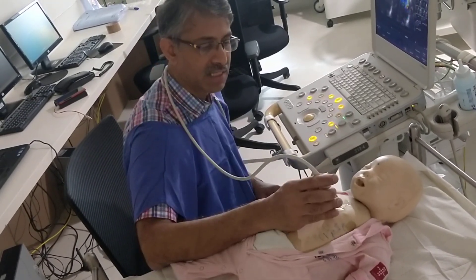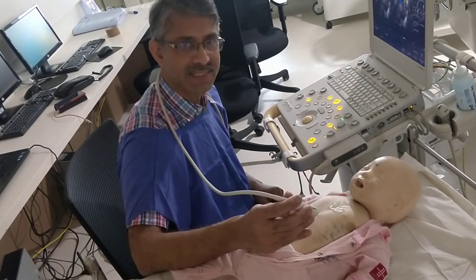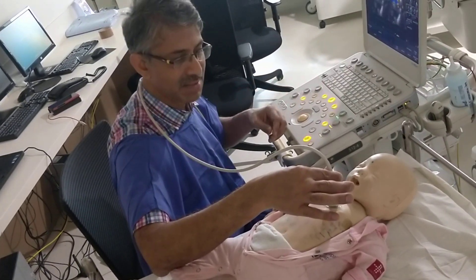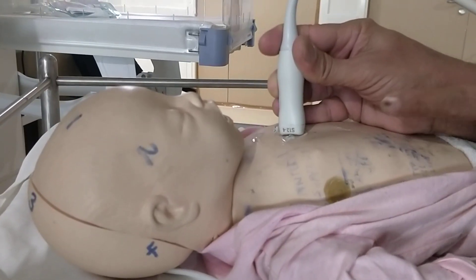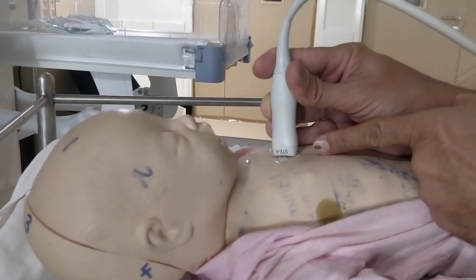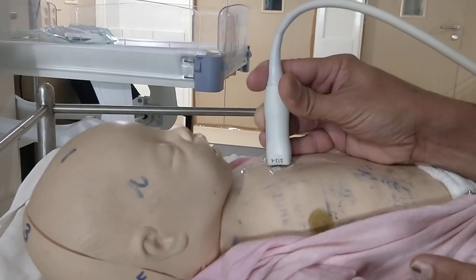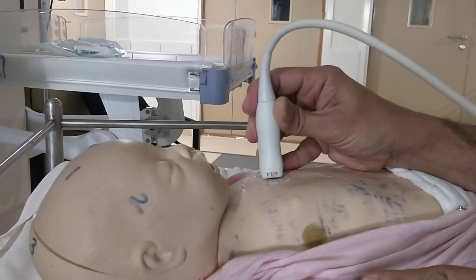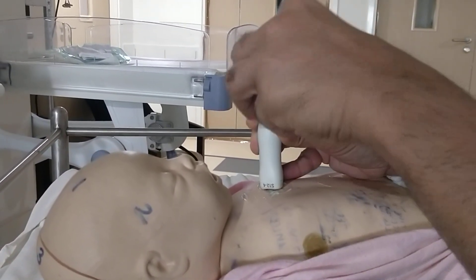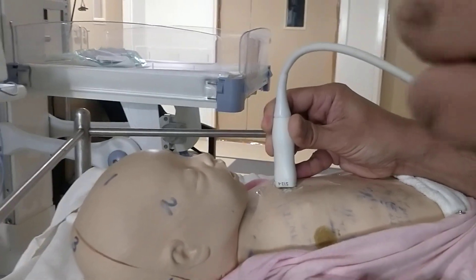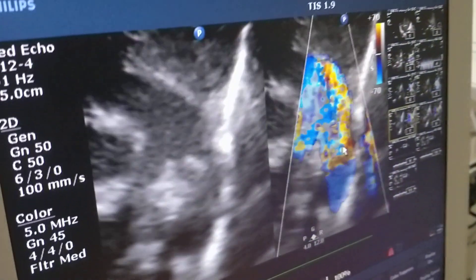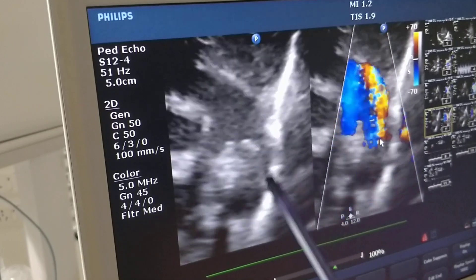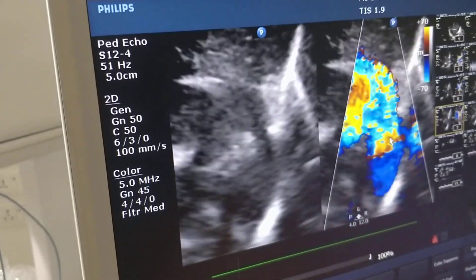I will now demonstrate ductus arteriosus using parasternal short axis. The probe is placed here — this is the parasternal short axis. To get parasternal short axis, you start from the parasternal long axis and rotate 90 degrees with the marker facing to the left shoulder joint to get this view.